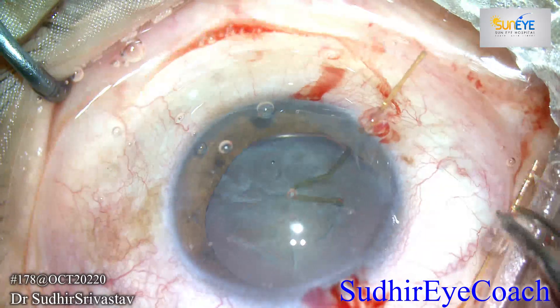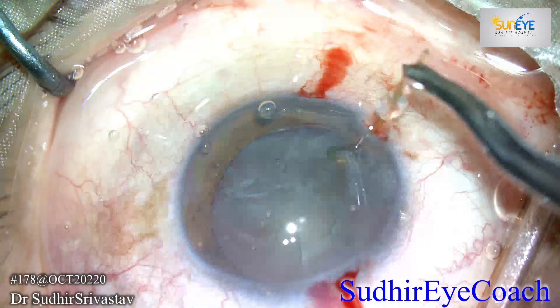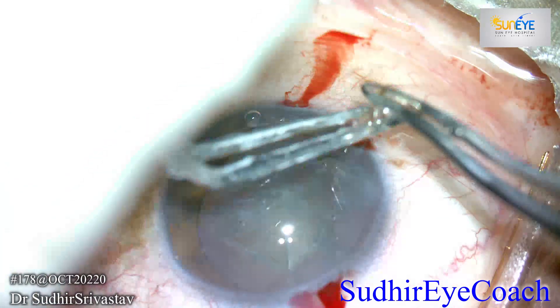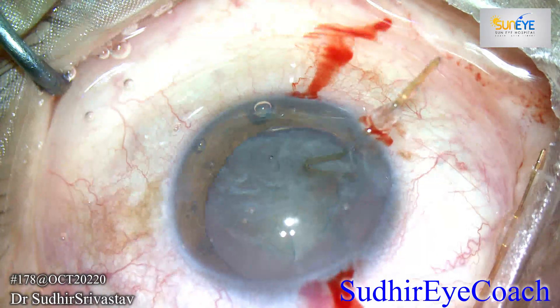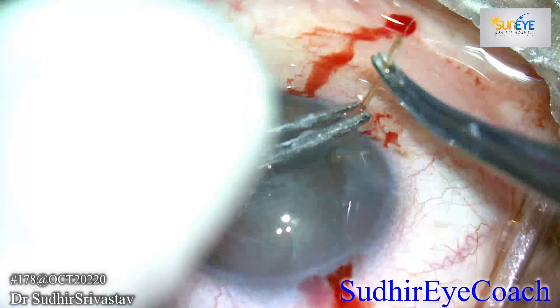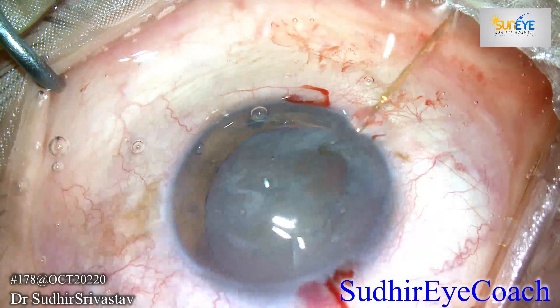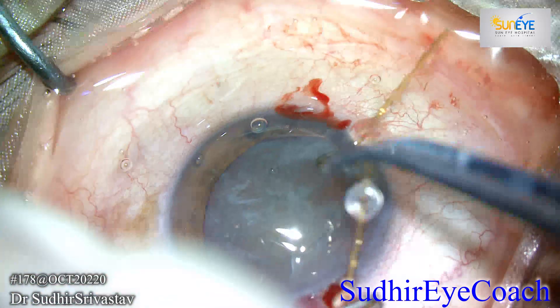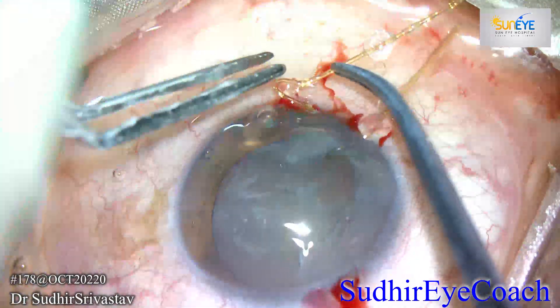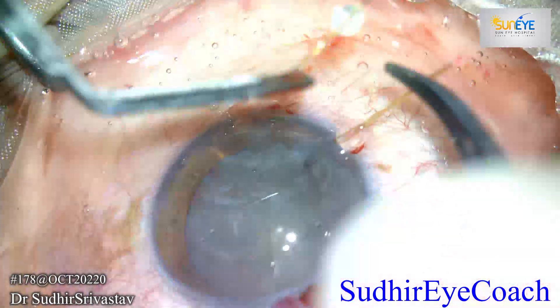Good visualization is very important because you want to see your structures so that you can place them in a proper position. Fill the chamber and place viscoelastics or fluids on the cornea so that you will get proper visualization under the microscope. I secured one iris capsular hook which supported the anterior capsule, then placed another capsular hook adjacent to the previous one.